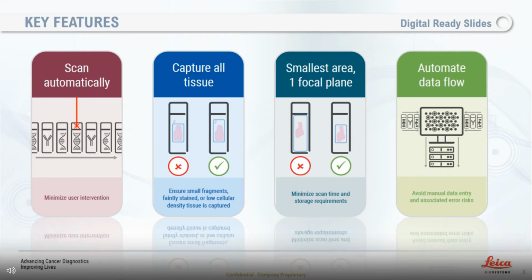And really where this comes to is you could capture the whole slide region for every single slide, but you're going to capture an awful lot of white space at usually high resolution scanning, and that is going to firstly take longer to scan, and secondly you're going to have the larger file size and then storage requirements that are unnecessary.